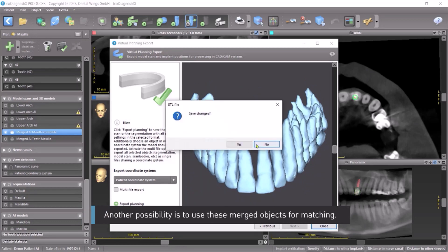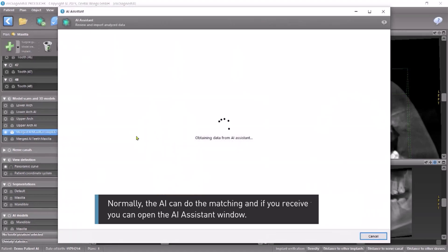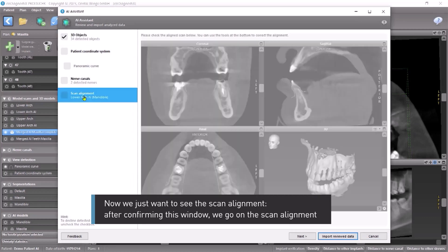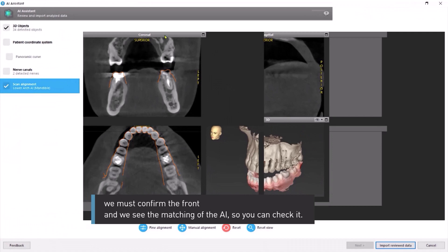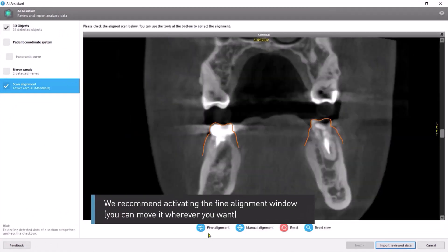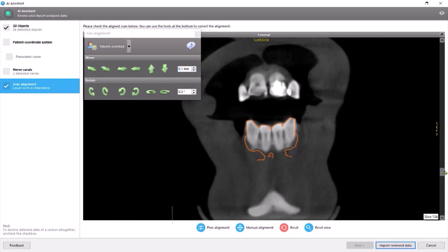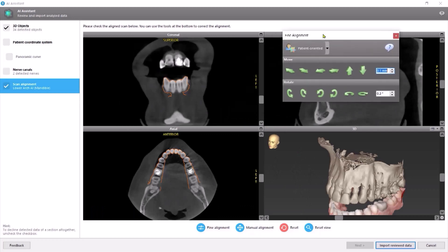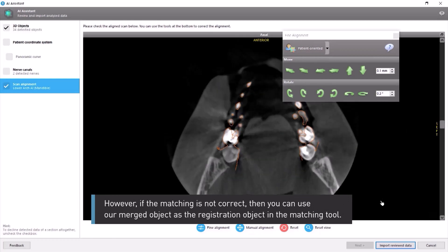Another possibility is to use these merged objects for matching. Normally the AI can do the matching, and if you receive the results you can open the AI Assistant window. Now we just want to see the scan alignment. After confirming this window, we go to the scan alignment, confirm the front, and we see the matching of the AI so you can check it. We recommend activating the fine alignment window — you can move it wherever you want and scroll through everything, so you can control and correct it with the fine alignment in different views. However, if the matching is not correct, you can use the merged object as the registration object in the matching tool.